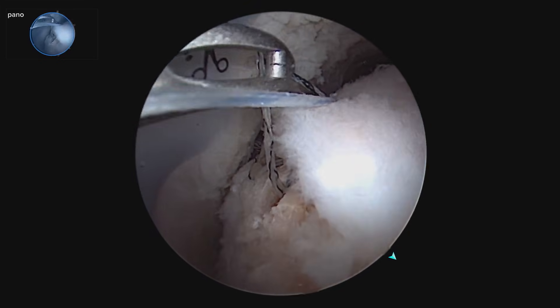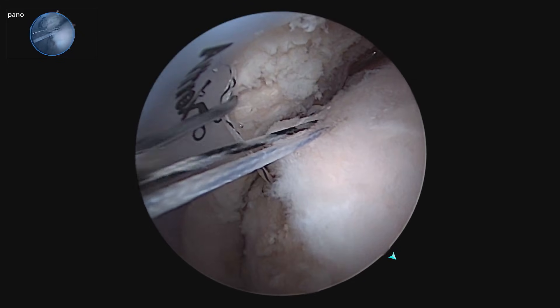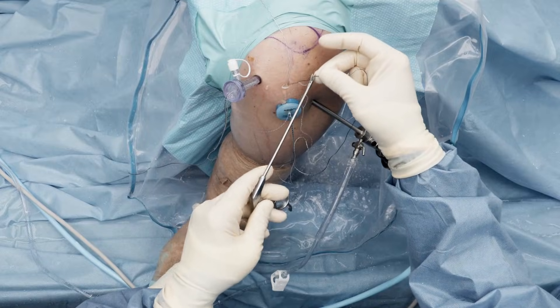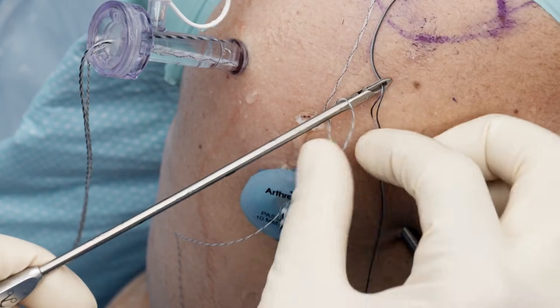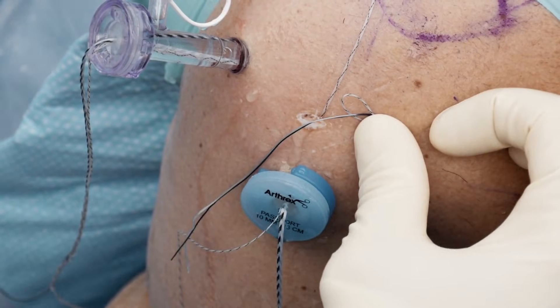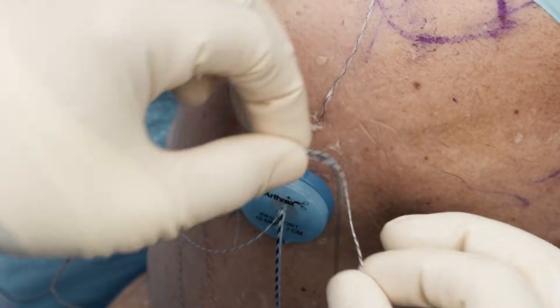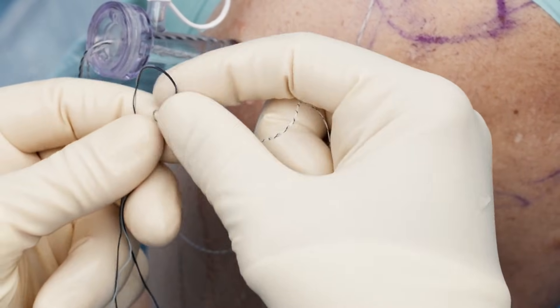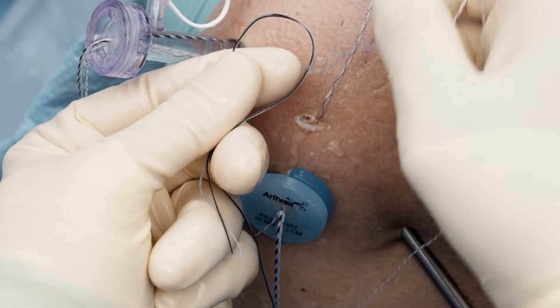I'm going to go in and retrieve the loop suture for conversion of the anchor. I'm going to take this, put it through the loop, and make sure it's at the purple mark — that's the purple mark. Both sutures are through the shuttle loop and I've got this ready to go. I will go ahead and convert this.